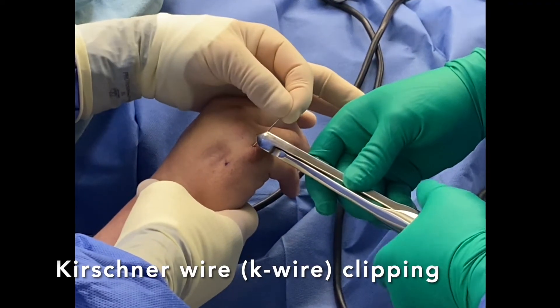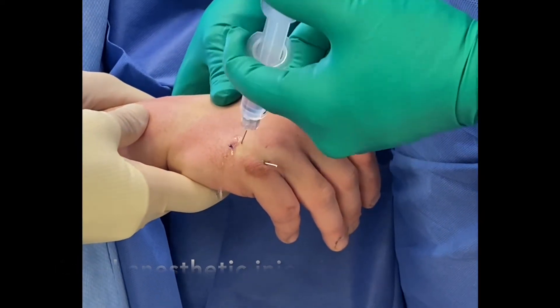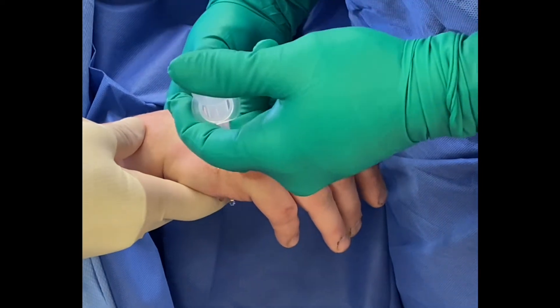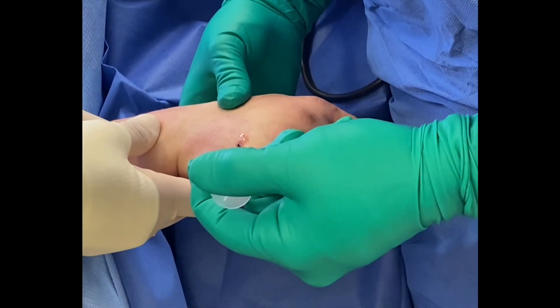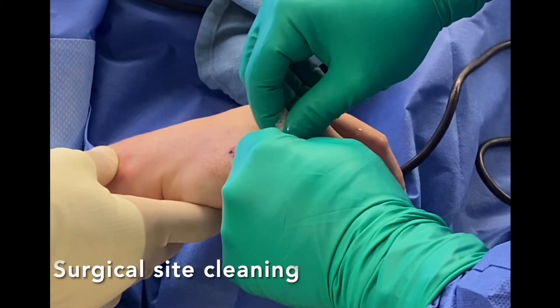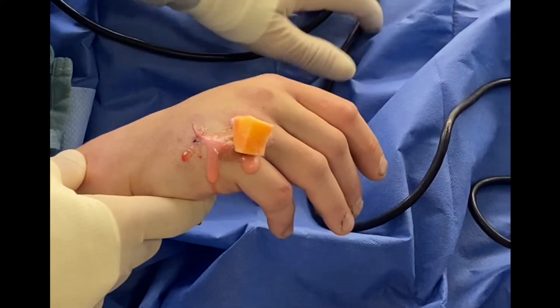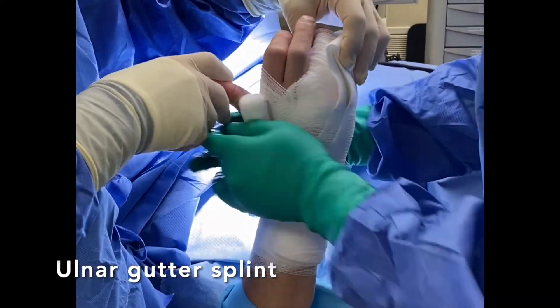The surgery is now complete. The K-wire is clipped off and a local anesthetic is injected around the area to minimize post-operative pain. After cleaning of the surgical site with chlorhexidine, the patient is placed in an ulnar gutter splint. The splint and K-wires will be removed in three weeks.